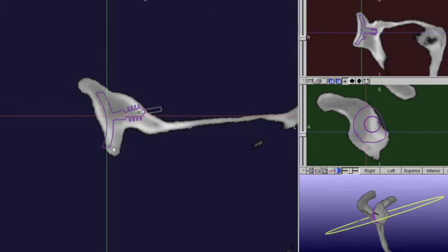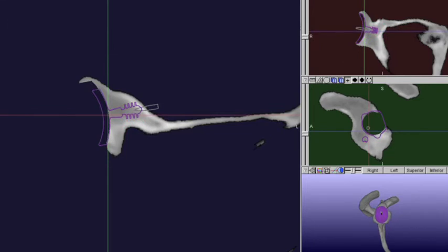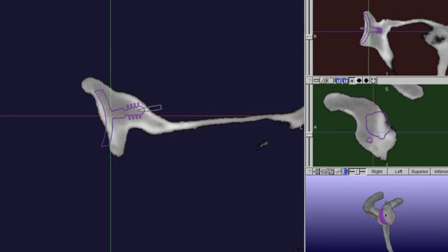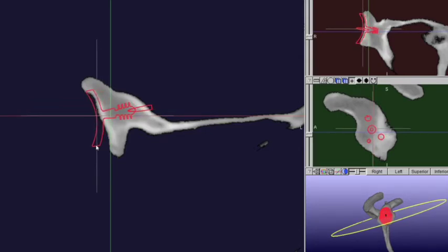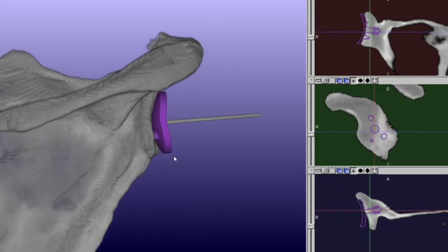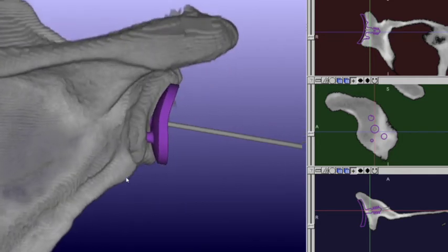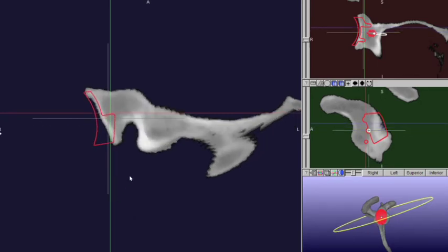Even increasing the implant's retroversion to 10 degrees to match the patient's anatomy still shows significant subchondral bone removal and significant medialization. Step five is to evaluate the need for an augment, bone graft, or reverse arthroplasty. Since a standard implant leads to too much medialization and removal of subchondral bone, we bring the implant to the ideal position and evaluate the amount of unsupported implant. Leaving only 50% back-side support is unacceptable. We then virtually trial an augmented implant and choose the appropriate size to obtain full back-side support.